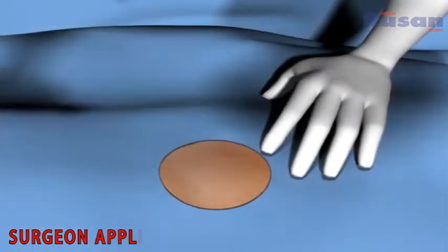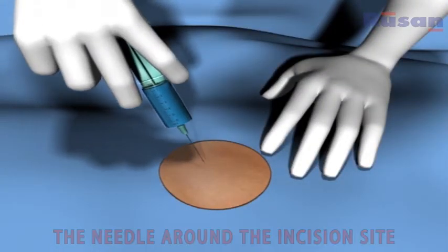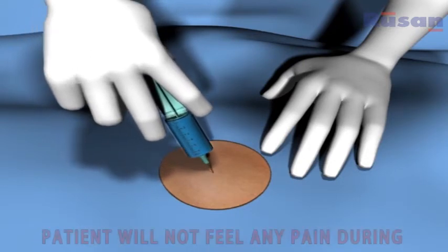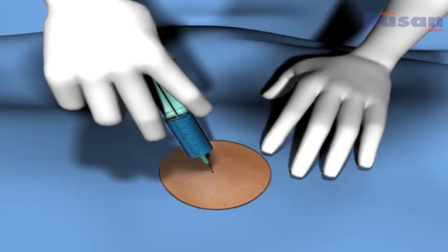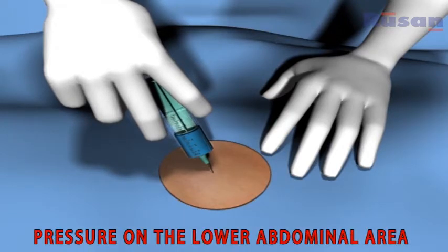Surgeon applies a local anesthetic, moving the needle around the incision site. Anesthetic is administered so that the patient will not feel any pain during the procedure. It is probable that the patient may still feel some pressure on the lower abdominal area.